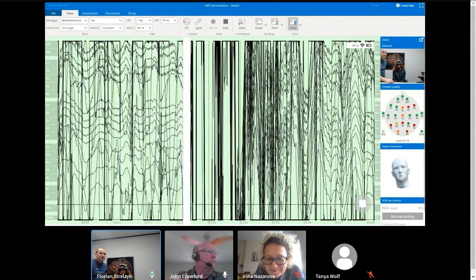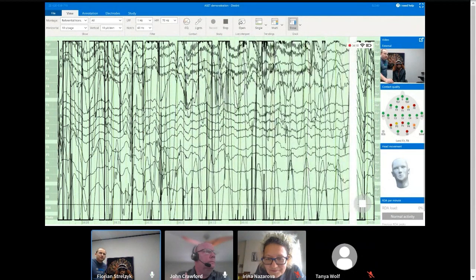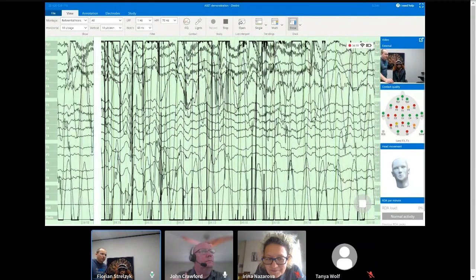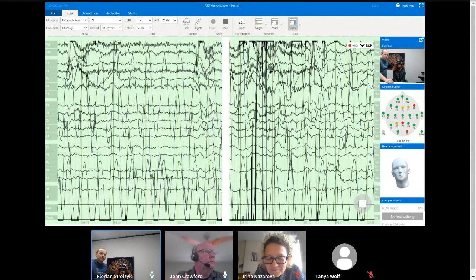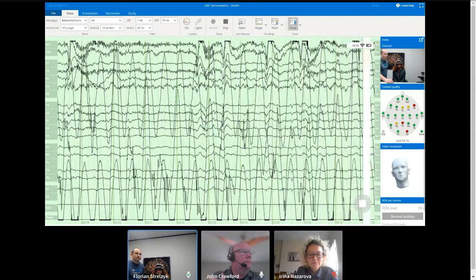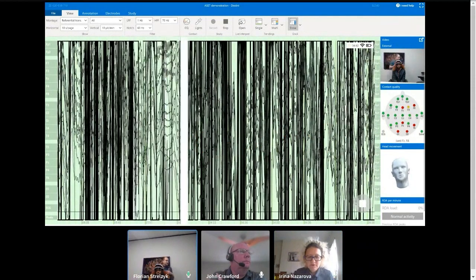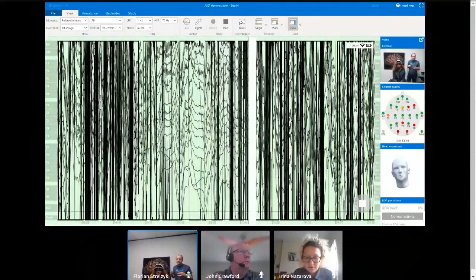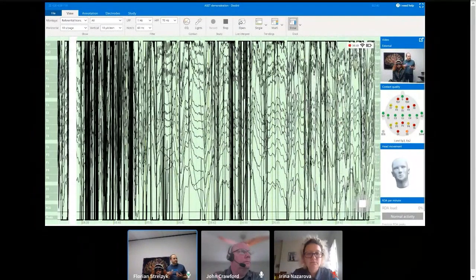So here you also see that a good amount of these electrodes are already green. And now I need to decide, do I want to wait for these electrodes to settle? You see some of them are already settling on their own. Or do I see some that I probably should address? For example, O2, I think I have to address. What I usually do is step back two steps physically, and then step closer. So 5 seconds, 6 seconds, it depends a little bit.